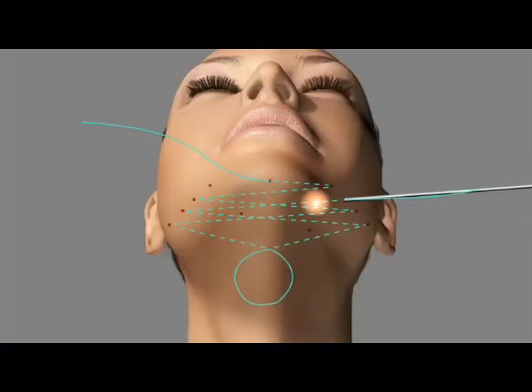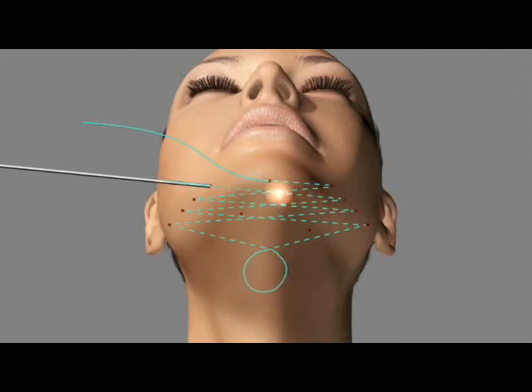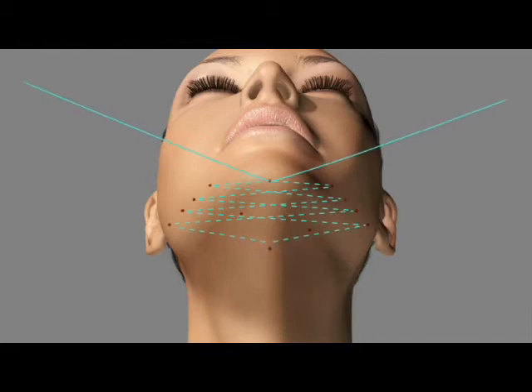With each passage of the suture rod in the subcutaneous space, the suture is grasped by the surgeon and pulled, thus keeping tension on the suture throughout the entire operation. If the surgeon does not do this and reaches the end of the operation with a loop of suture out of the submental incision, it is almost impossible to tighten it at this time, secondary to the braided nature of the suture and the weaving around several ligamentous attachments.